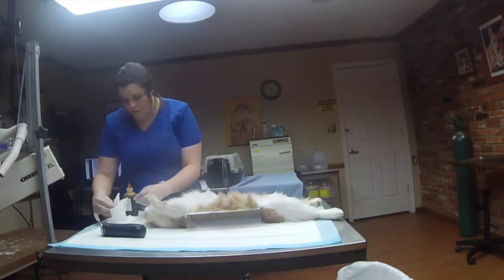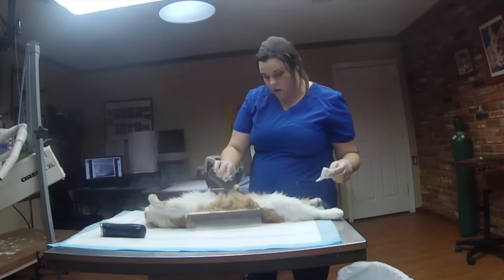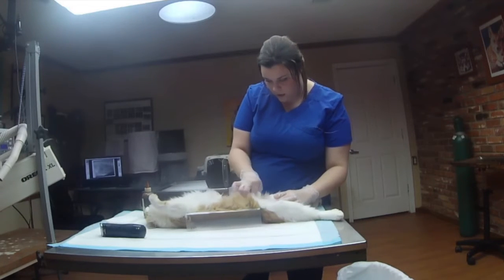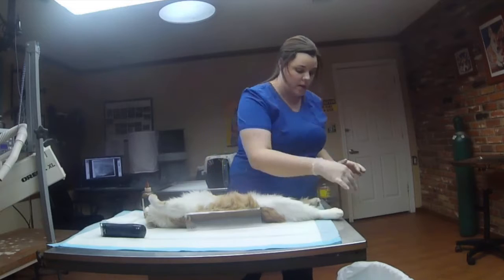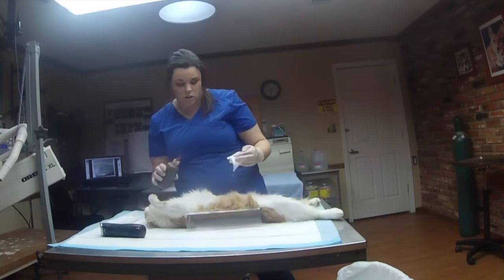And then we have iodine in here, and you're going to want to go down the middle and then go around the sides. You're going to want to do that about 3 times before you take your surgical patient in there.